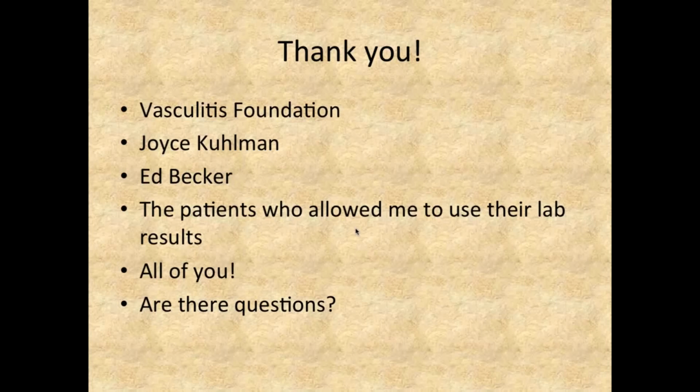Mm-hmm. Thank you. One question came in. My doctor's ordering a punch biopsy. Can you tell me a little bit about this test and what to expect? The punch biopsy gets its name because it's a little cylindrical instrument that punches out a small piece of skin and some underlying dermal tissue underneath.